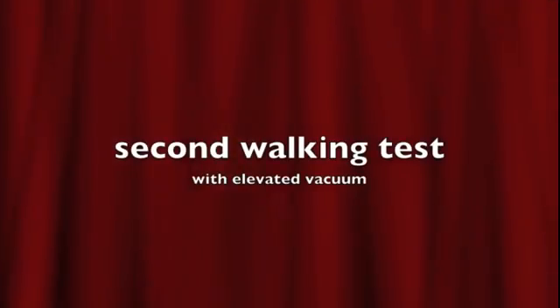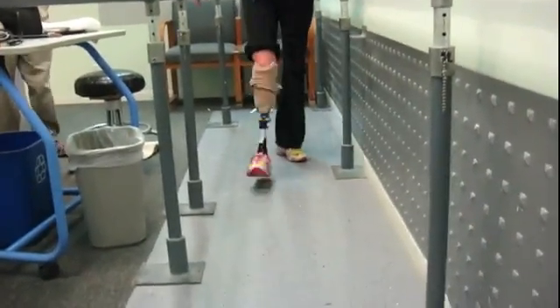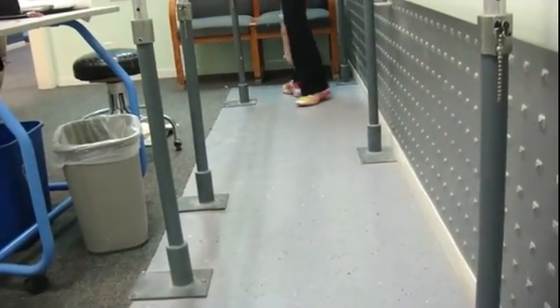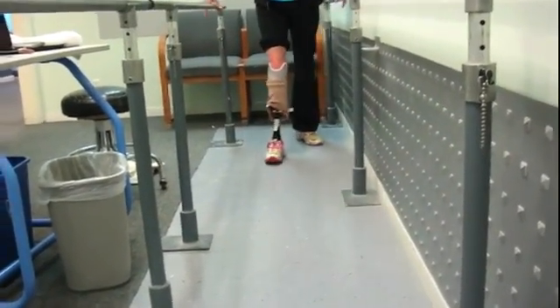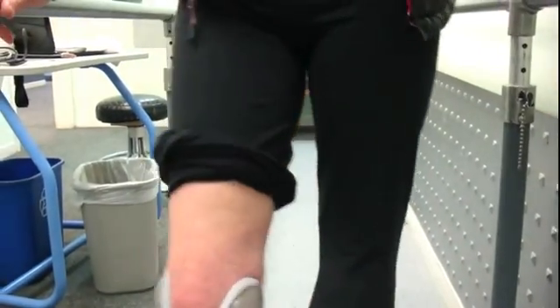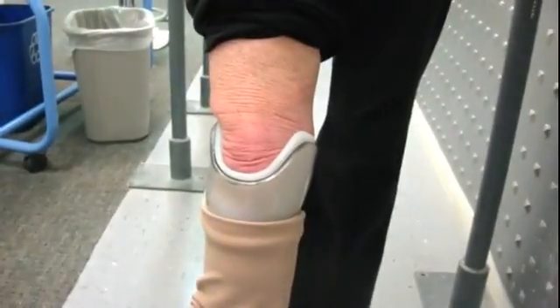It's actually going to work. Basically the whole idea is not to have to have a sleeve. Let's pull that sleeve all the way down — just pull it down all the way out of the way. Now it's completely free. Now you'll have as free a knee action as you can possibly get. Much better — there's nothing behind your knee. Instead of a sleeve like that, she could use pantyhose.